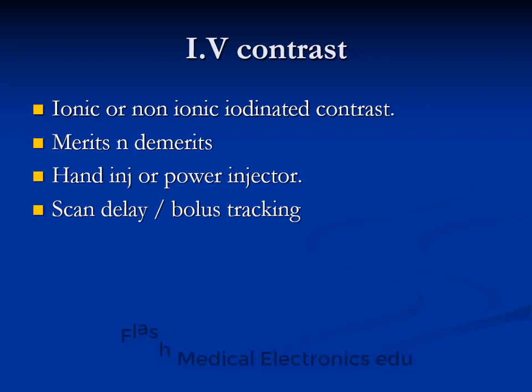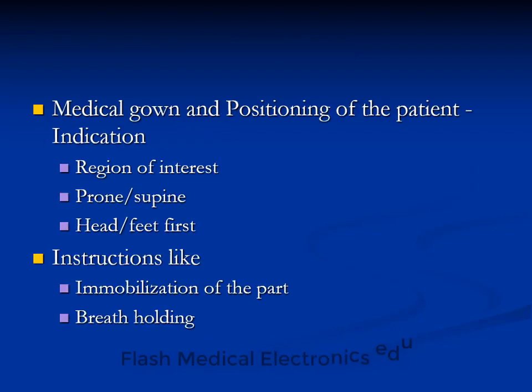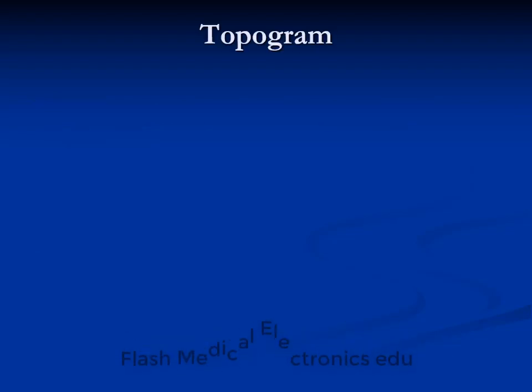Scan delay, bolus tracking. Medical gown and positioning of the patient, according to indication and region of interest. Prone or supine, head or feet first. Instructions like immobilization of the part and breath holding. Topogram.